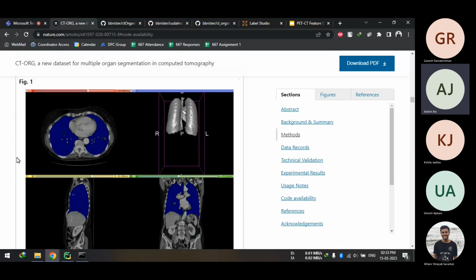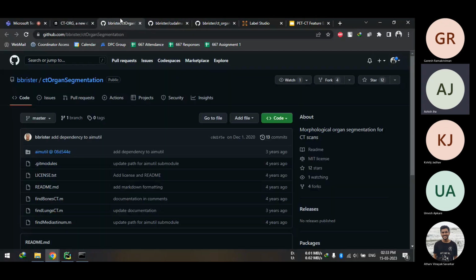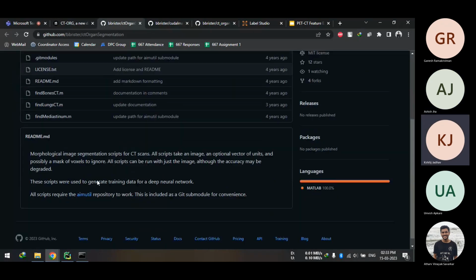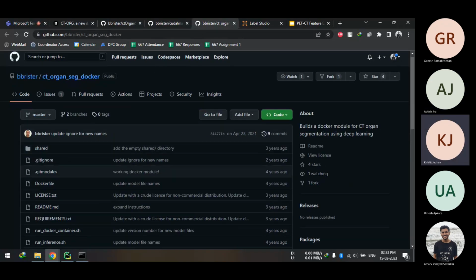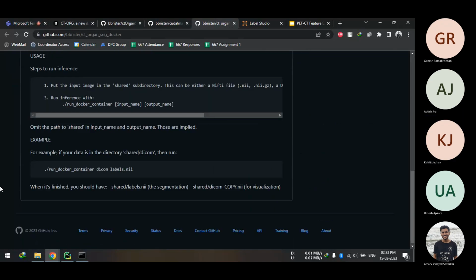No, actually, this is volumetric segmentation. They have 2D segmentation as well, and they have reformatted it into 3D segmentation. Yeah, but we did not use everything, right? We use just two-dimensional, and it should be okay. Yeah, so I think that is very possible. Actually, Atharva, you will have to check this. Okay, sure, I will check this.